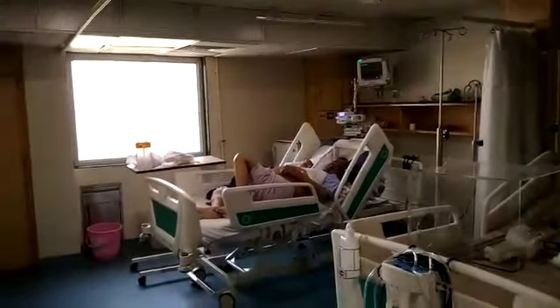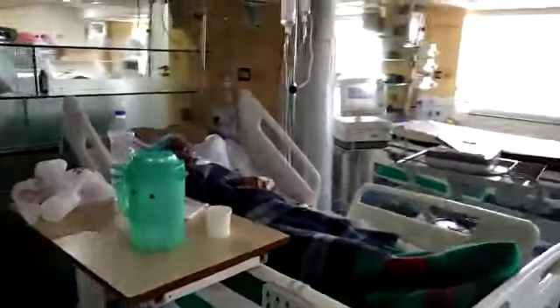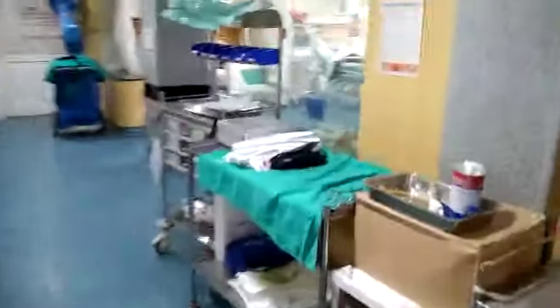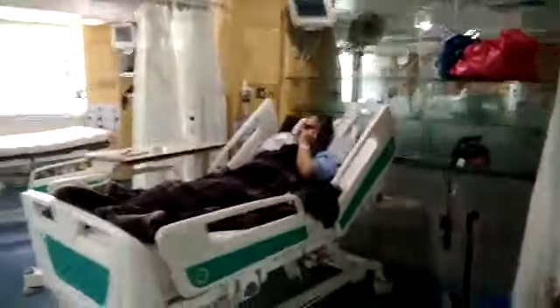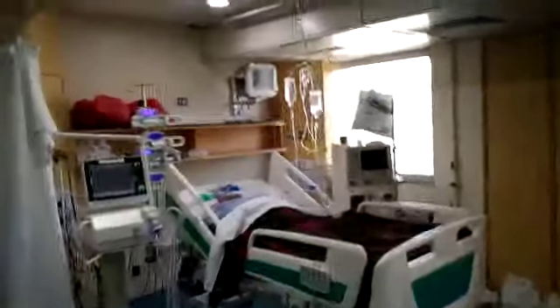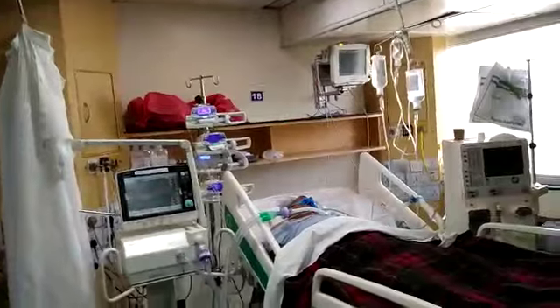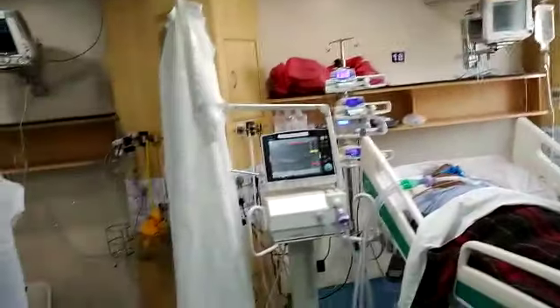एक पेशेंट ये है डायबिटिक हाइपरटेंसिव. एक पेशेंट ये है डायबिटिक हाइपरटेंसिव CKD. ऑल केम विद द कंप्लेन ऑफ शॉर्टनेस ऑफ ब्रेथ, सोर थ्रोट, डिस्निया, सम विद अनकंट्रोल्ड शुगर. एक पेशेंट ये हैं हमारे, ये सिर्फ अभी ब्रीदिंग मास्क पे हैं. एक पेशेंट ये हैं CKD के पेशेंट हैं. ये नॉन केस ऑफ डायबिटीज़ हाइपरटेंशन. सीडेटिव्स पे हैं, आयनोट्रोपिक सपोर्ट पे हैं और वेंटिलेशन पे हैं.